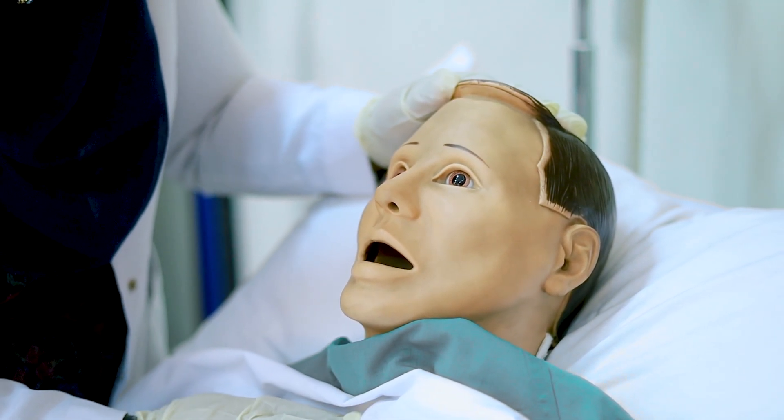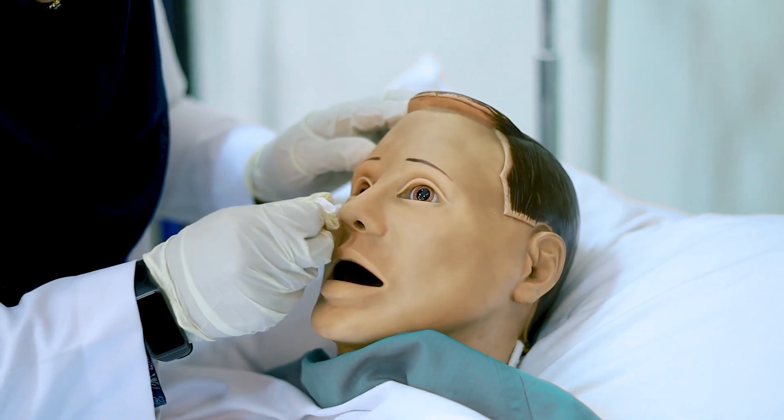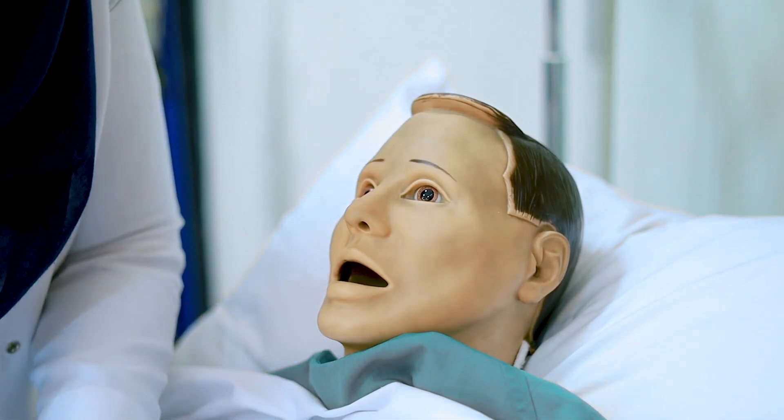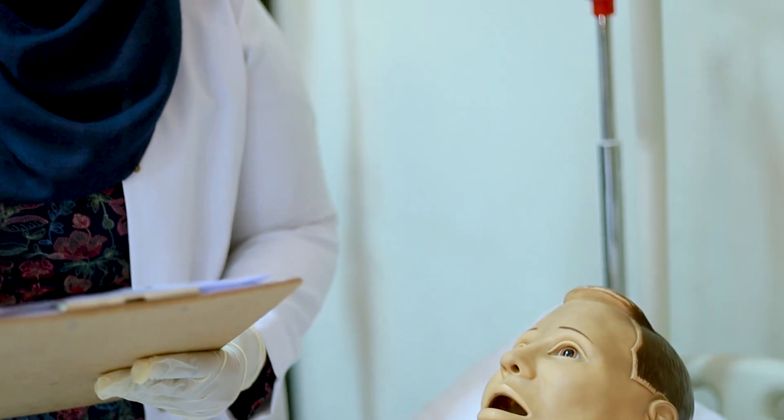Now clean the patient's nose. At the last step, make the client comfortable. Always remember, whatever procedure you are doing, document it. Write the date, time, the amount, and the color — document everything.